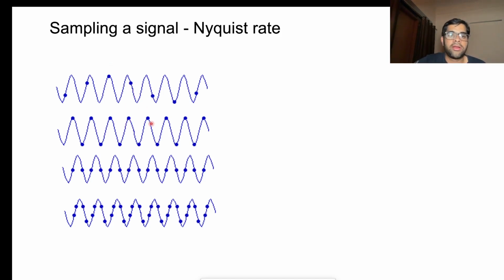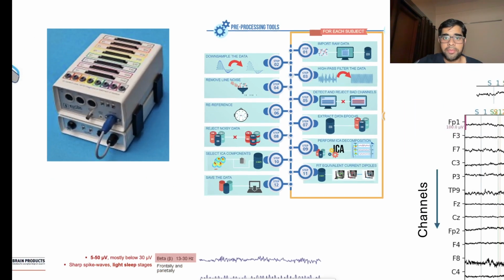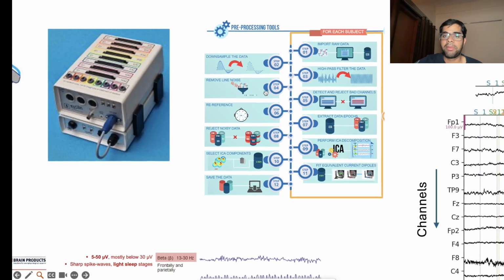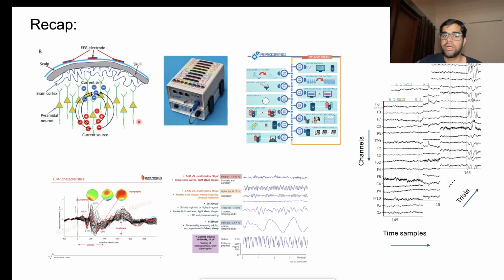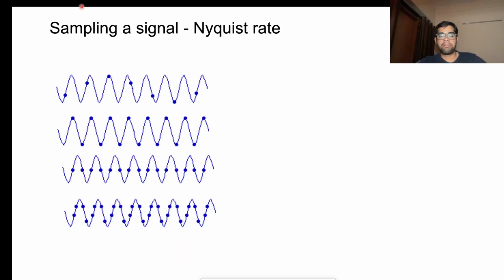Also, we have seen something in the pre-processing steps here. Here you see something we call sampling, downsampling, and this ADC box. Generally the physical signals are continuous signals, but you send it to the computer or any storage device using samples of it. We can't send the full continuous signal to a computer, so we need to do sampling. So let's discuss a bit about sampling.